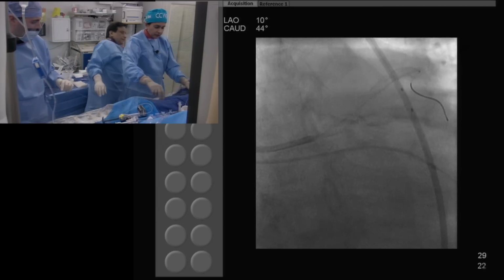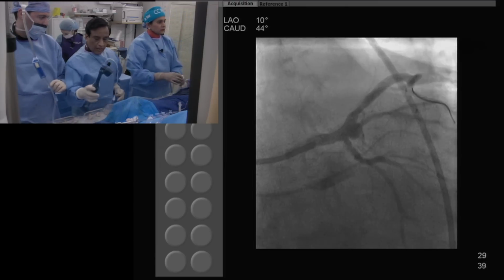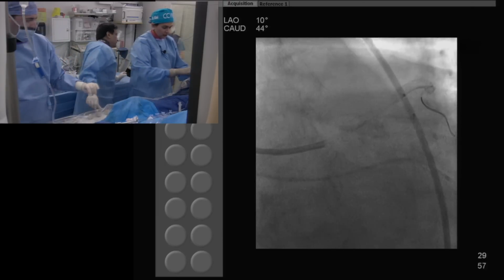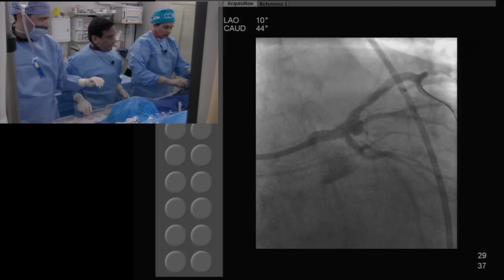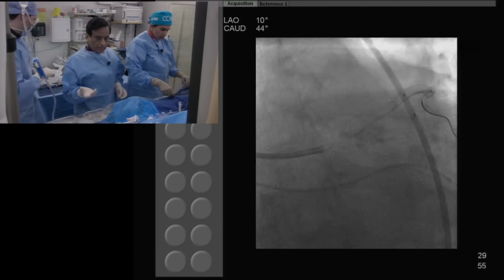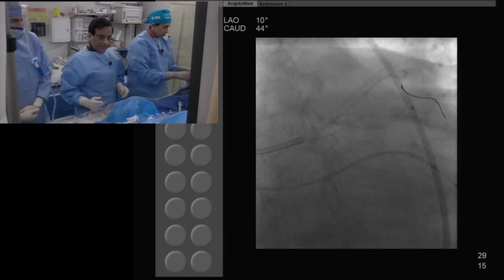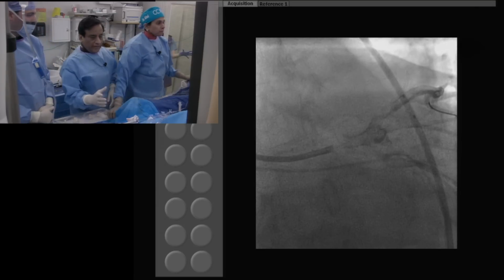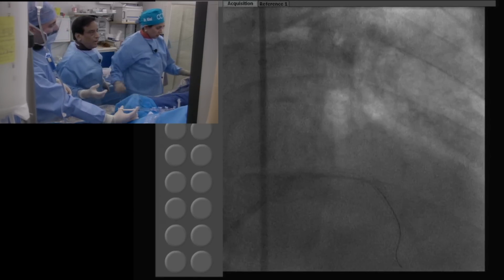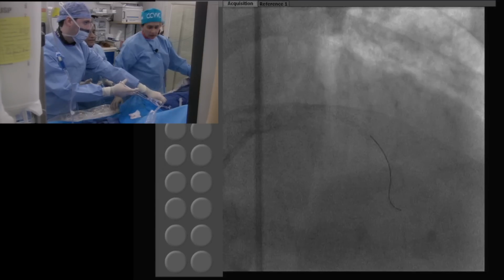I think this is the answer to one of our viewers who asked the question whether to do a CAT scan. Dr. Altir from Libya asked about a patient who is going to go for surgery. This is just an atherosclerotic aneurysm. The most common cause of a focal or saccular aneurysm is atherosclerosis. The patient has a significant lesion, and these patients do very well with the intervention, and you are able to close it as part of the intervention. So why risk an additional procedure, dye and so forth? That was the reason we did it.